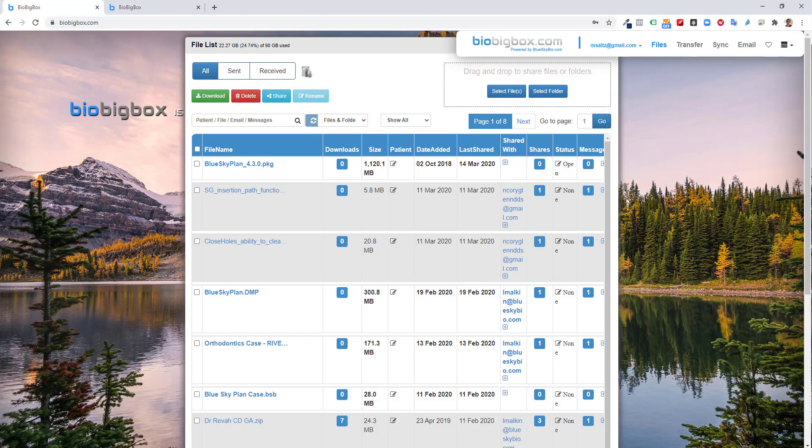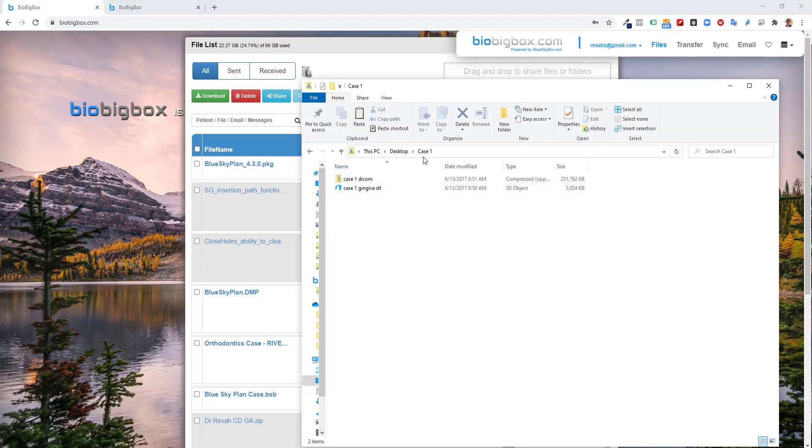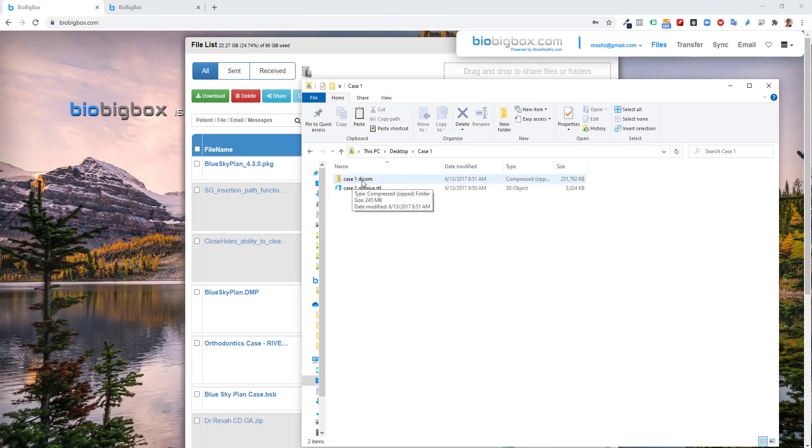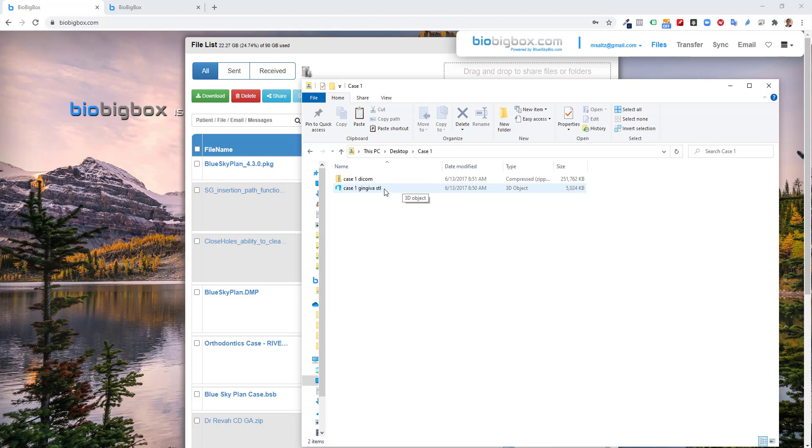What I set up on my desktop right now is I have case one. That's the case I'm going to demonstrate with. I have my CT scan files. They could be zipped and put into a particular folder, or they could be unzipped. Either way is fine. And we have the STL file, which we're going to need to import into the blue sky bio case, into blue sky plan case, in order to design and create the surgical guide. So now, let's say I want to send these files to a lab. I would like to have them prepare the treatment plan.